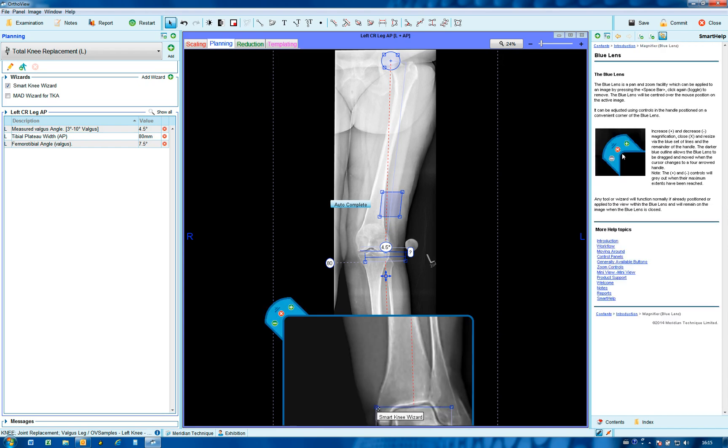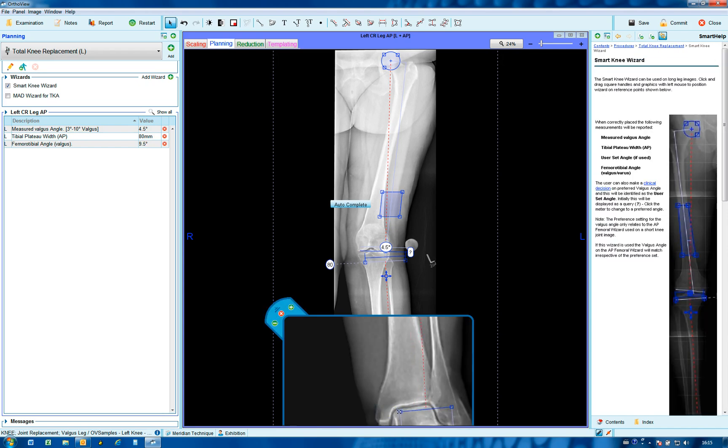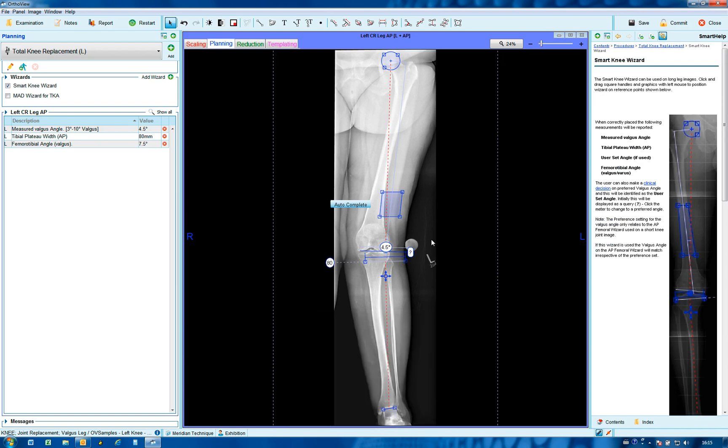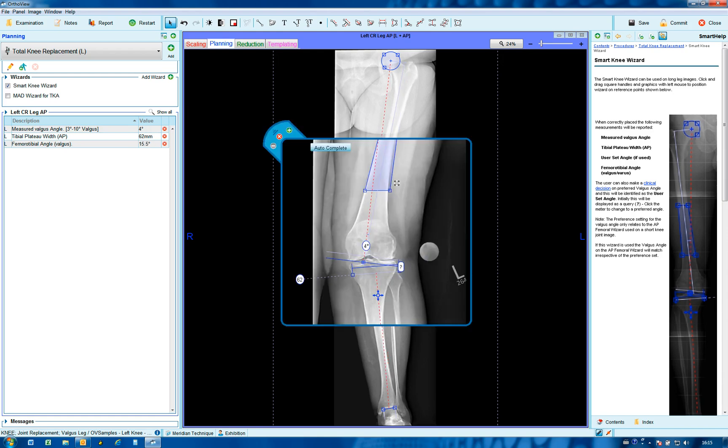Similarly here to position on the ankle joint. In this particular wizard, auto-complete will bring the magnifier up to assist you in confirming that the positioning of the auto-complete has been correct.